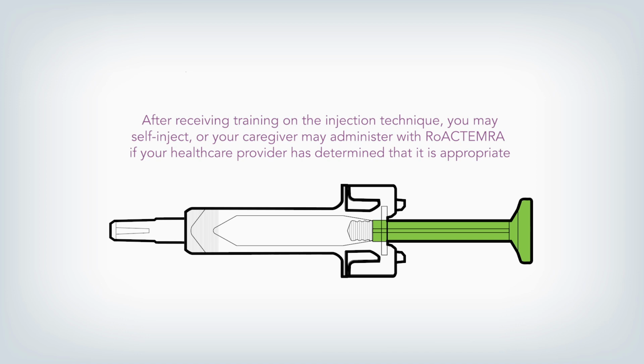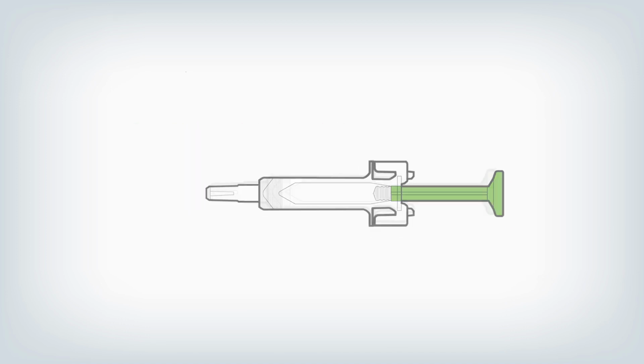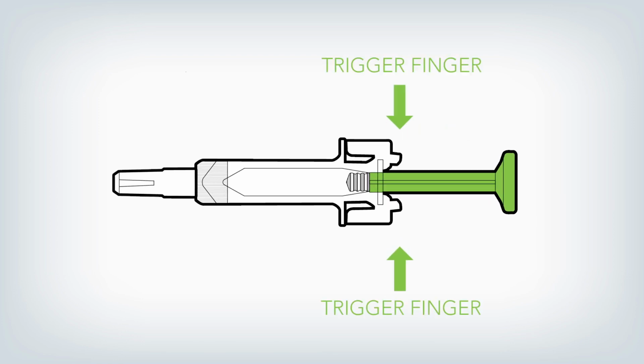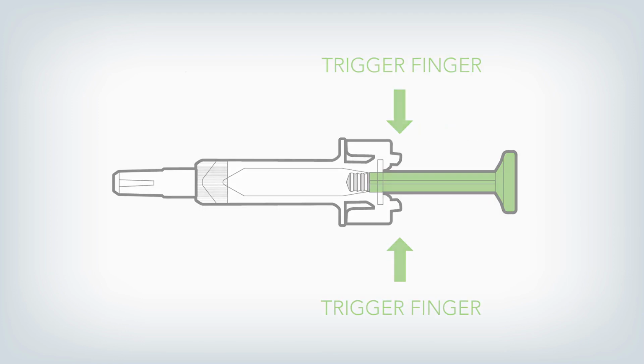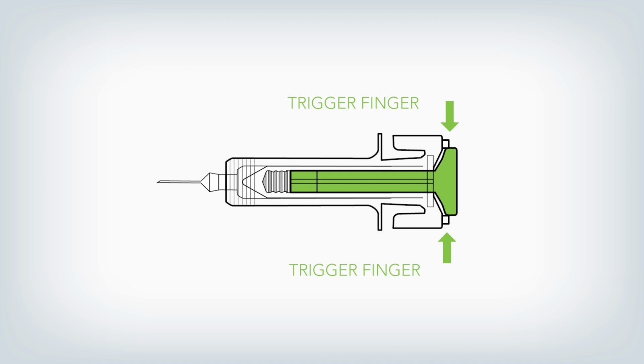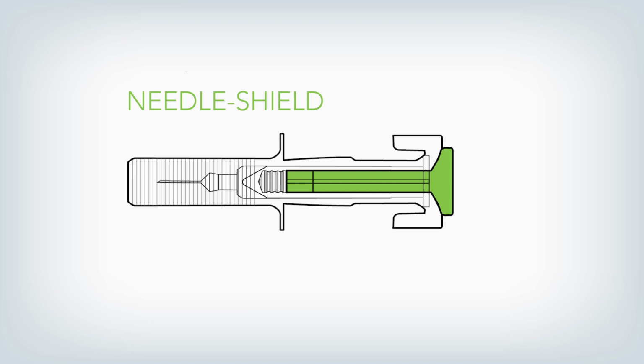The single-use prefilled syringe has several features to help you self-administer a preset dose of ROACTEMRA correctly. A protective needle cap covering the needle. A plunger which you press to inject your prefilled syringe. And these trigger fingers. You need to avoid pressing them so that you don't activate the needle shield too early. However, at the end of the injection, the plunger will touch these trigger fingers and release the needle shield. Each syringe has a safety feature called a needle shield that helps prevent accidental needle stick injuries by automatically covering the needle after the injection.